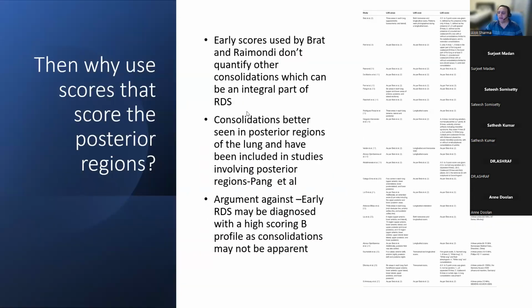Now, this meta-analysis is really nice, and again, it's part of your Dropbox. But basically, what it lays down is that Brat's method and the anterolateral methods used by DiMartino is the commonest method. It is also, amongst all these studies, and I know this slide doesn't read very well, the most commonly adopted method for clinical management amongst units all over the world.